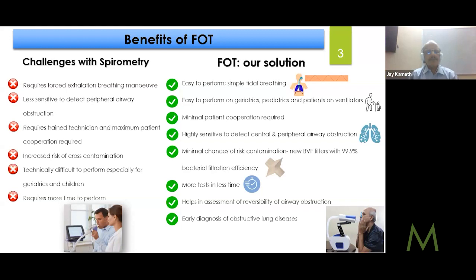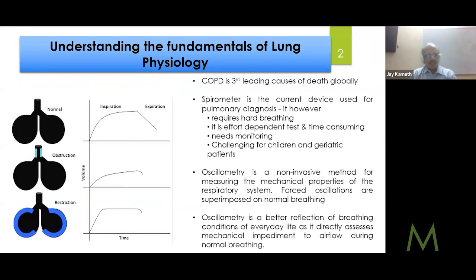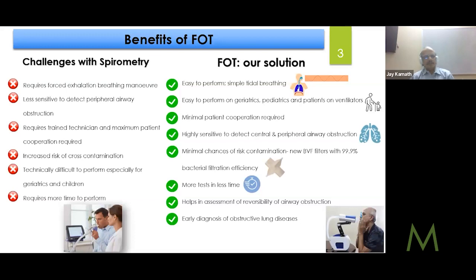So just for everybody's information, a PFT device is used primarily for both what we call lung obstruction as well as restriction. By obstruction, what I mean is asthma, COPD, and those kinds of conditions where I'm not able to breathe. There is obstruction in the lung pipe, so that's why it's called obstruction. Where the actual obstruction is happening is something that we get to know with this device. Restriction is ILD, for example, where we are unable to breathe because the lung sacs are, I'm not able to hold the entire breath. This is called restrictive. PFT is used to diagnose both of these.